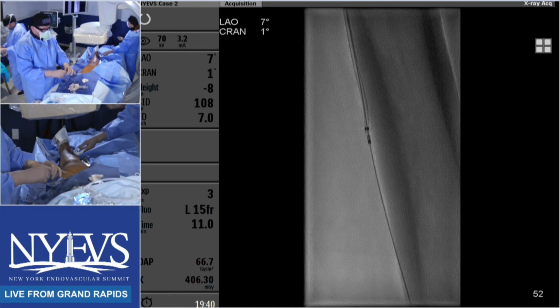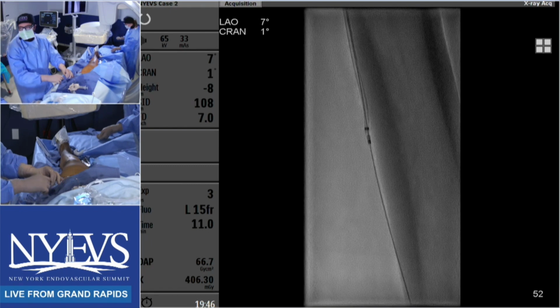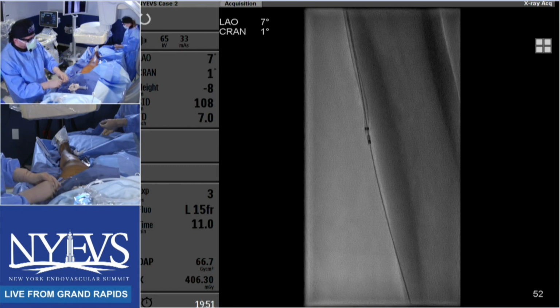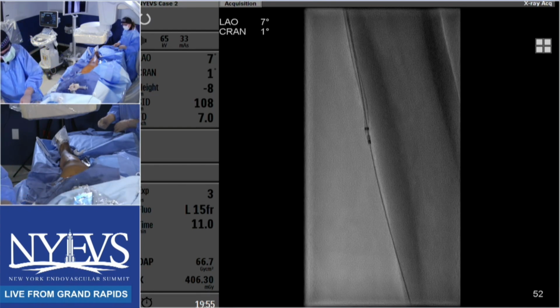I see that all the time where we have patients with large tissue loss. And by the time they start healing, or they're clearing an infection, the duplex is showing some reduced flow, some problems. We have to re-intervene to start over, start the clock again. So it is a reality, to your point.